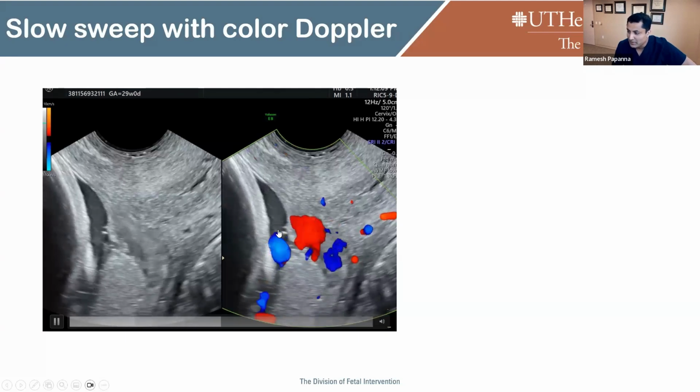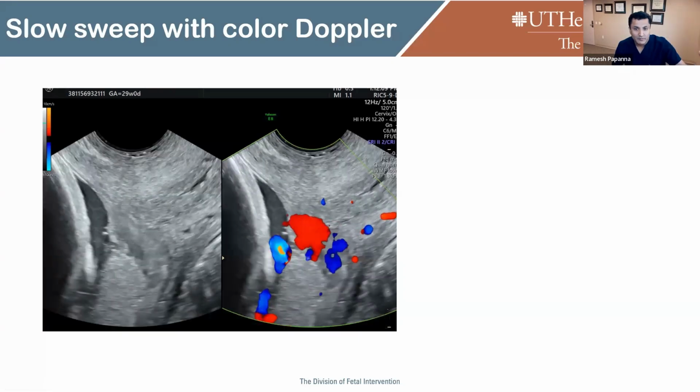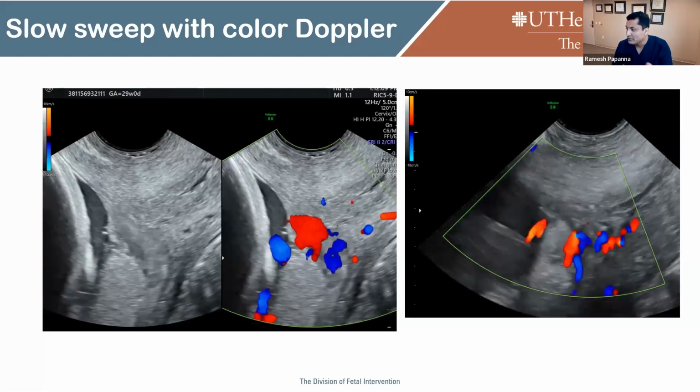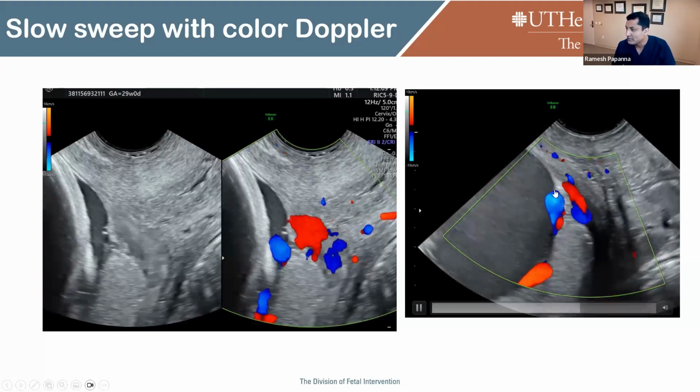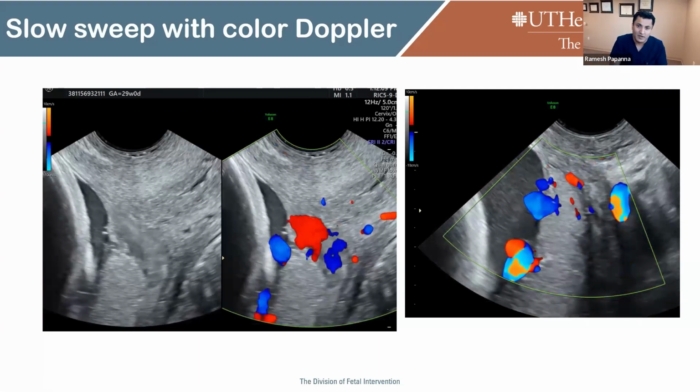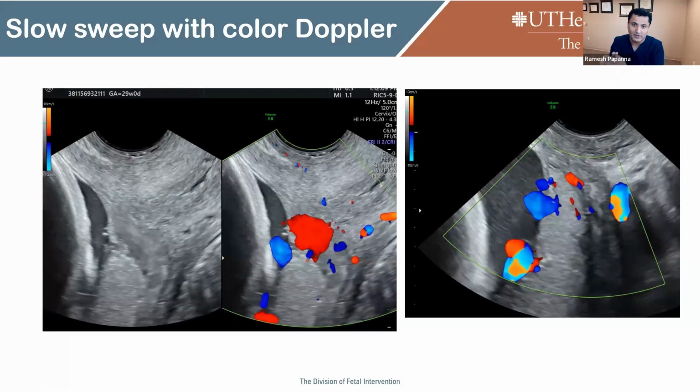I'm not sure how many have picked up a little Cheerio right there. That is a vessel that is bulging into the amniotic cavity outside the placental territory over the internal os. In the same patient, if you slow down and follow side to side sweeps, you can see that vessel is actually outside the placental surface and flowing as a vasa previa. So you have a marginal placenta previa with a velamentous vessel running on the edge of the placenta, and I also have a vasa previa sitting over the internal os. It can be that simple, or if something else is distracting your eyes, you don't pick up a vasa previa sitting over the internal os.